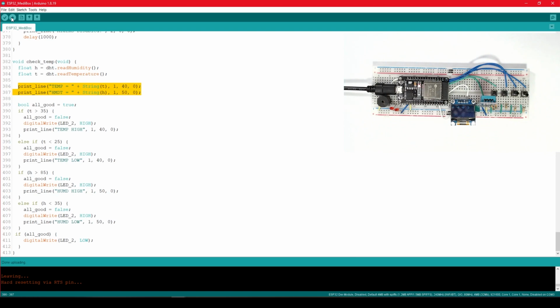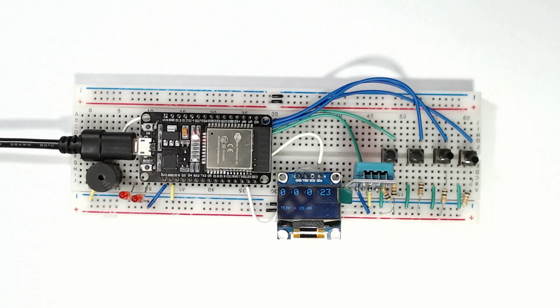Now it looks much nicer, but the push buttons will be a little unresponsive because of the delay I added in the loop.